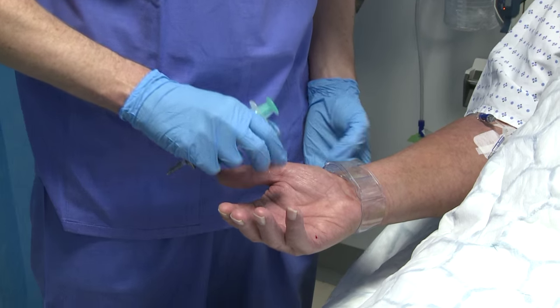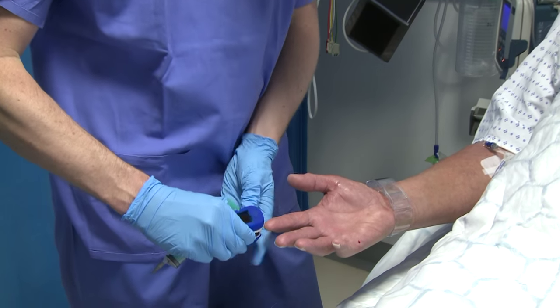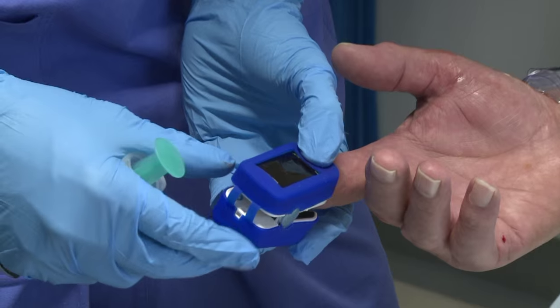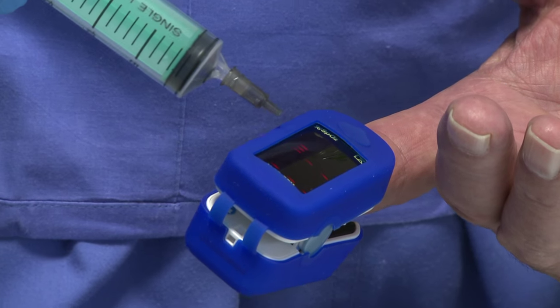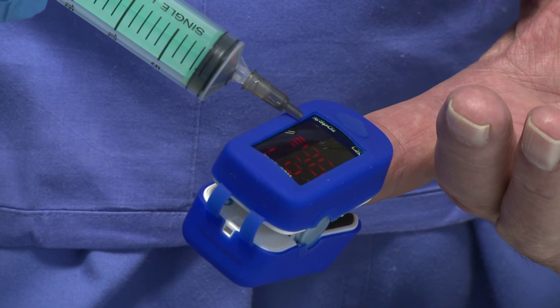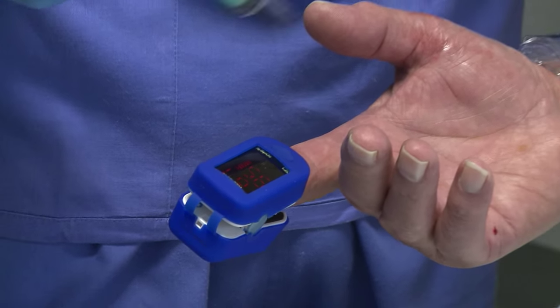To do so, we want to be sure that we have adequate circulation to the hand. We attach an oxygen saturation probe to the finger — here we have a mobile saturation probe which is very useful in this scenario. We can see very usefully that we have a pulsatile waveform here, just with this equaliser-type graphic, achieving a saturation of 95.